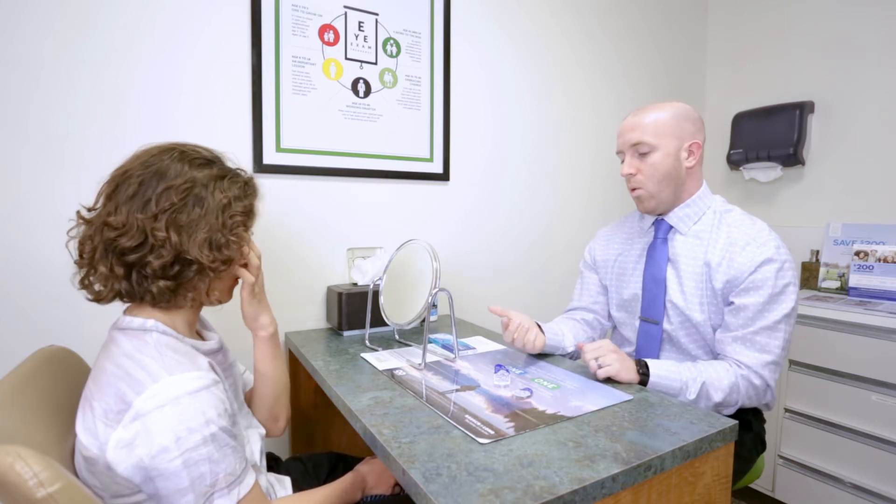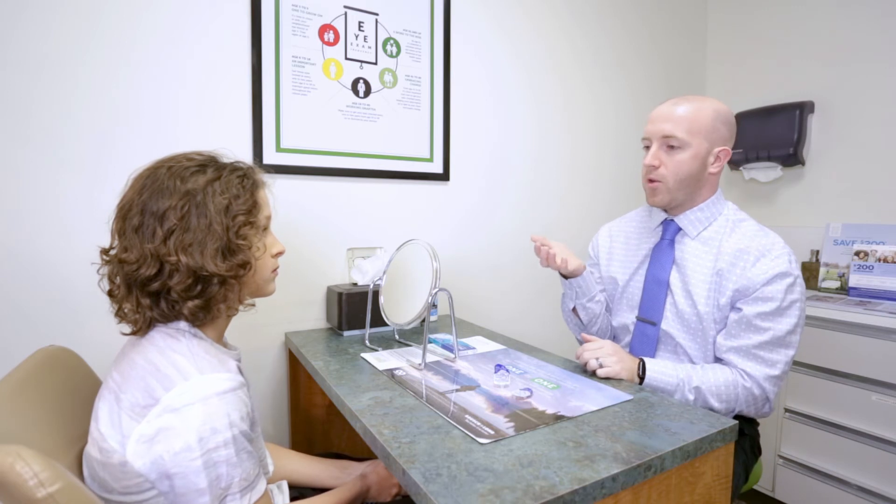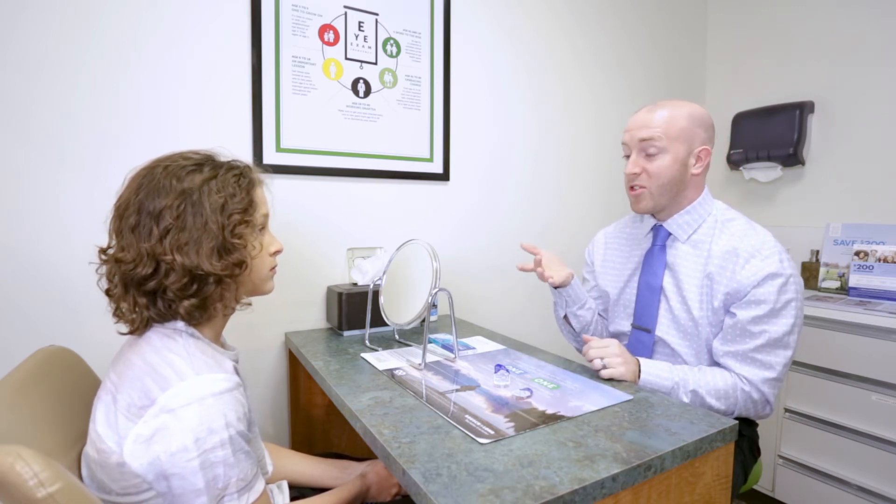If you look at it, it looks nice like a little bowl, and there doesn't seem to be anything wrong with the lens, which is great. Since it's your first time wearing contacts, you're gonna use both hands to really get the lids far out of the way so it's nice and easy to put the contact right on your eye. Eventually it'll be super easy — probably just one hand — but until you get used to it, use both.